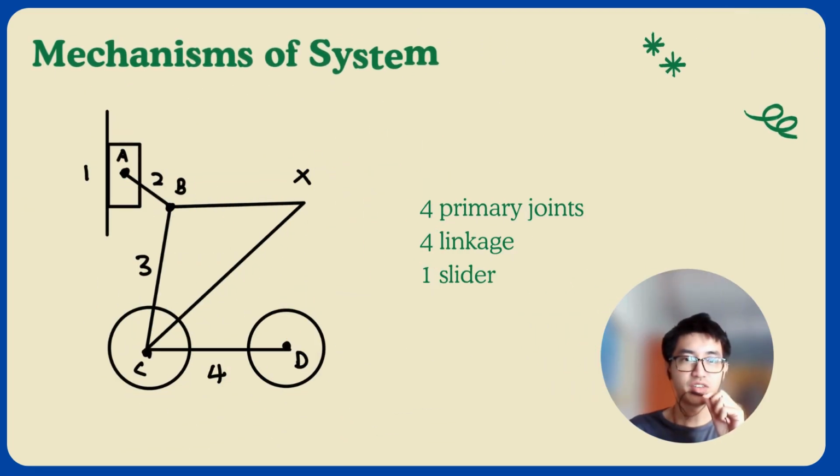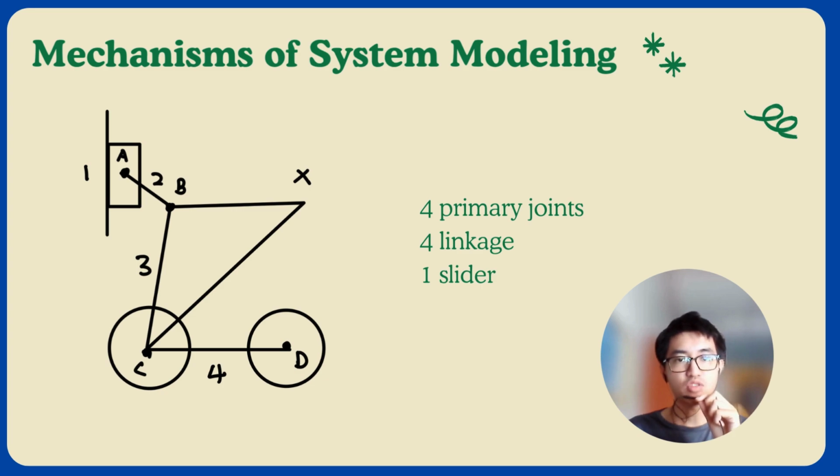Hi, Doctor. My name is Alvin Chandraliang, and here is our kinematic diagram for the wheelchair that we have drawn. In this diagram, we have a total of 4 links and 4 primary joints, as the joints are only connected with simple links, which causes them to be only primary joints but not complex joints. The 4 bar mechanism occurs at the location of the main wheel with the handle, where when the user turns the handle, the 4 bar mechanism will also turn the main wheel, which causes the whole movement of the bar.